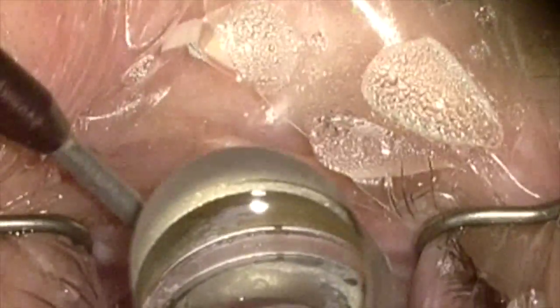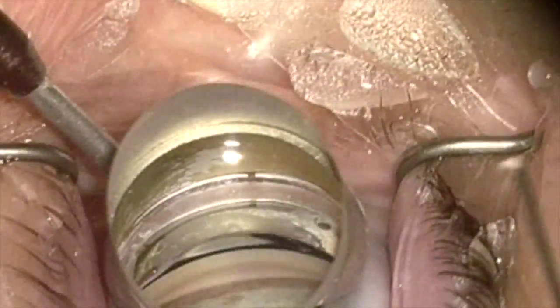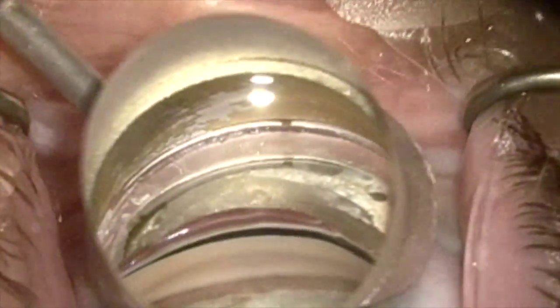I'm going to drop the gonioprism onto the eye using a cohesive viscoelastic as a coupling agent, then enter the eye with the eye stent straight in, parallel to the iris plane.